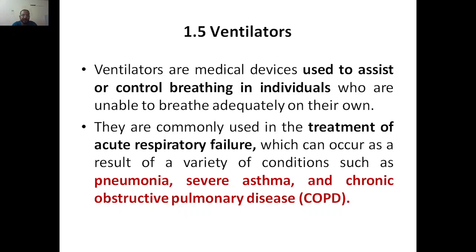Whenever there is acute respiratory failure, you experience difficulty in breathing. You almost stop breathing. During that time you need ventilators, and it can occur as a result of a variety of conditions such as pneumonia, severe asthma or COPD.